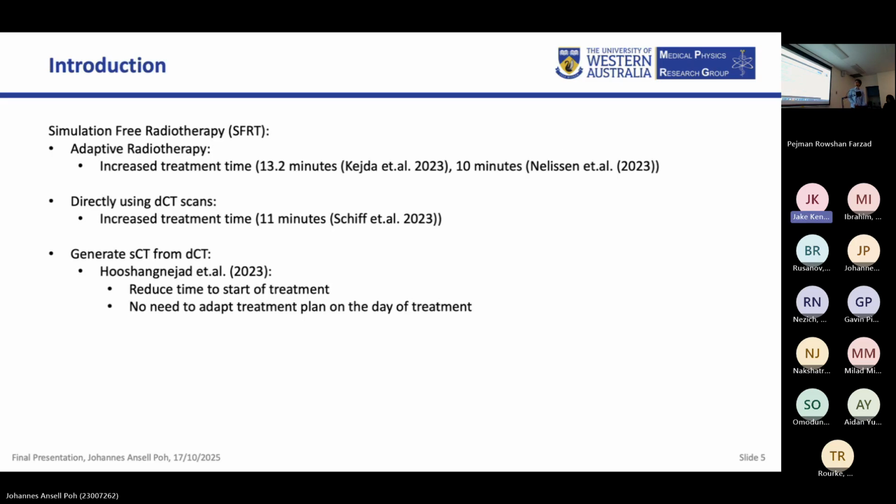There is some literature available on simulation-free radiotherapy, or SFRT. This refers to radiotherapy that doesn't require the patient to come in for a planning CT. The first method of doing this is adaptive radiotherapy, where the treatment plans are generated on the diagnostic CT images.